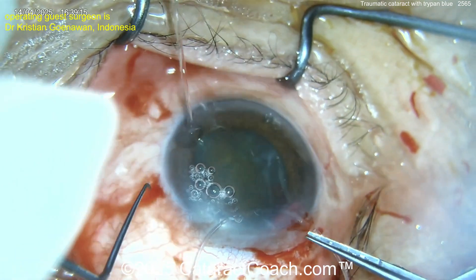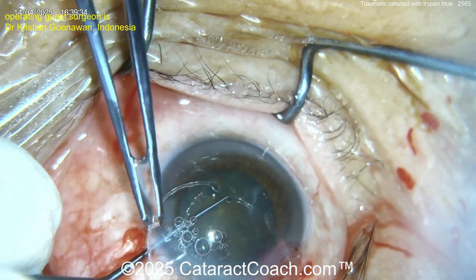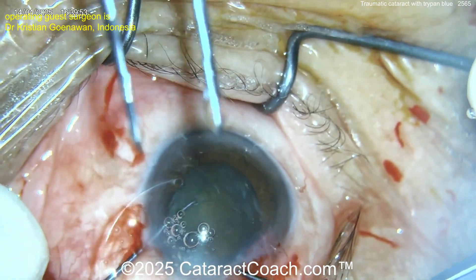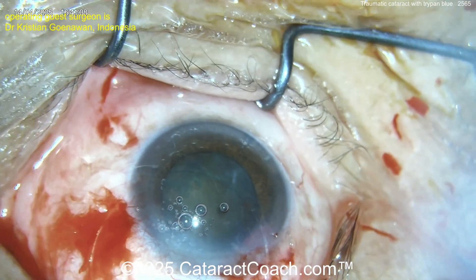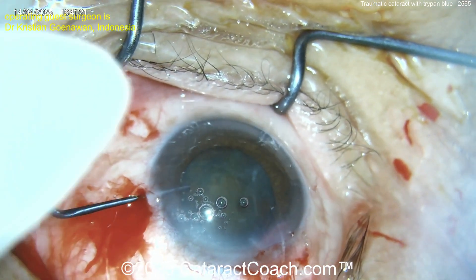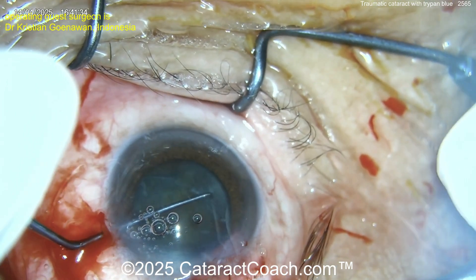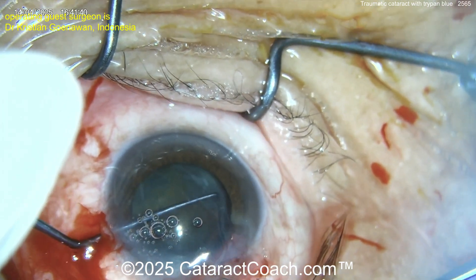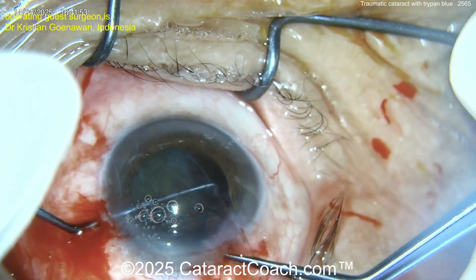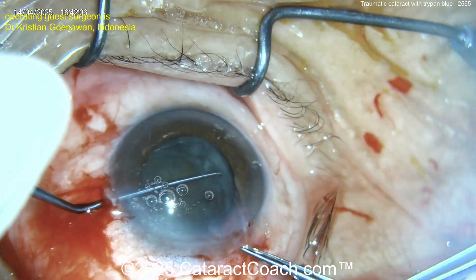Here comes the CTR — I'm watching the video for the first time with you. Using a Sinski hook to guide it. I'm not sure where that CTR is going — it's partially in, just the tip. The whole nucleus is moving a lot. When placing the CTR again, you may want to start off with capsule hooks at the beginning of the case to stabilize the lens as you remove the cataract and stabilize the bag.